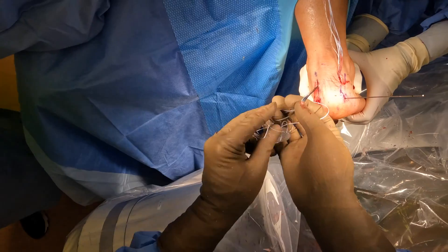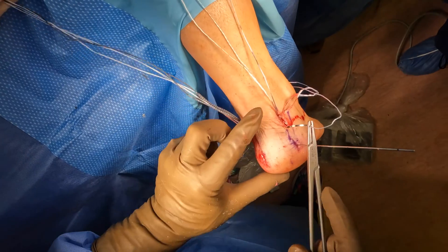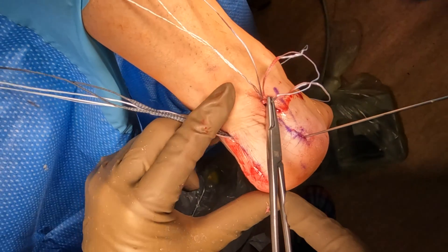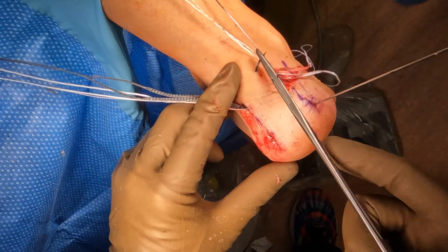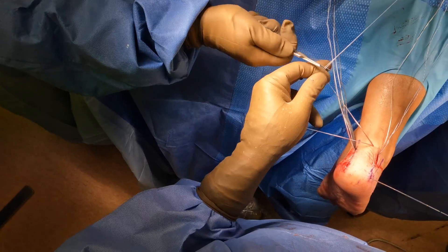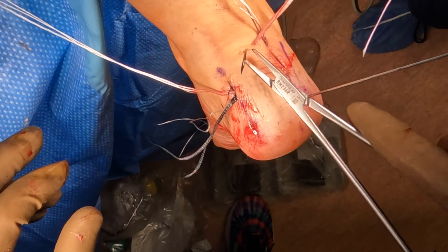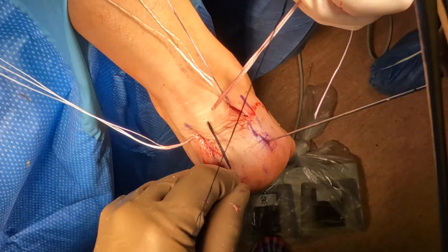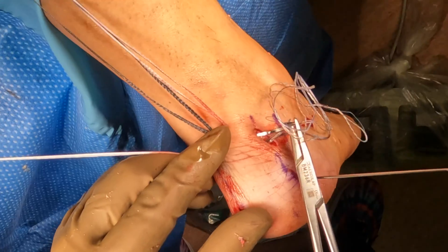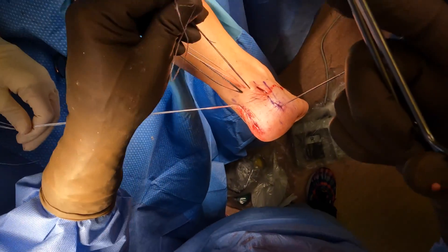What we're inserting here are the knotless suture tacks, also known as knotless fiber tacks — suture tacks are somewhat different. The next step is to expose these different sutures and fiber wires or fiber tapes on the back of the heel. These are on the superior portion of the heel, and we're bringing them through the skin in separate planes because we want these to be extra-tendinous as they pull the tendon back to the heel bone.